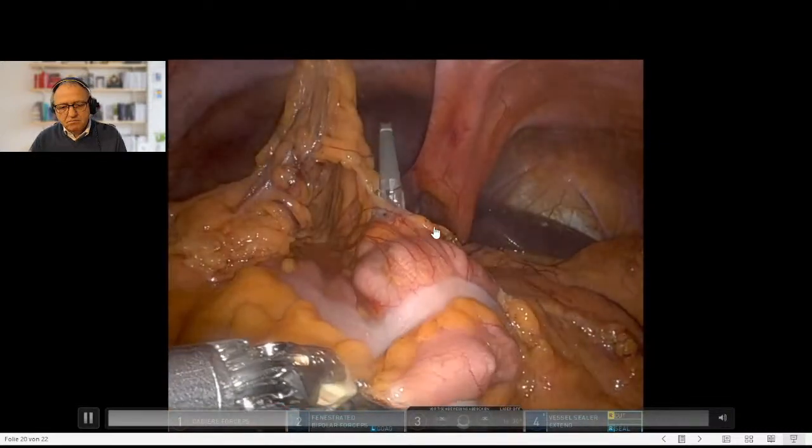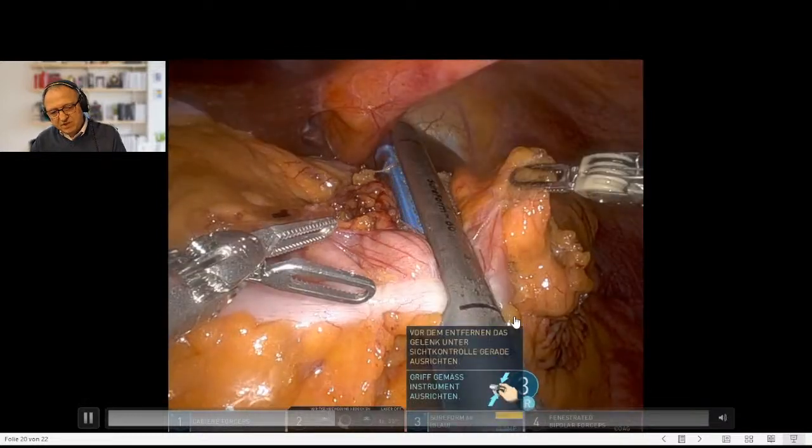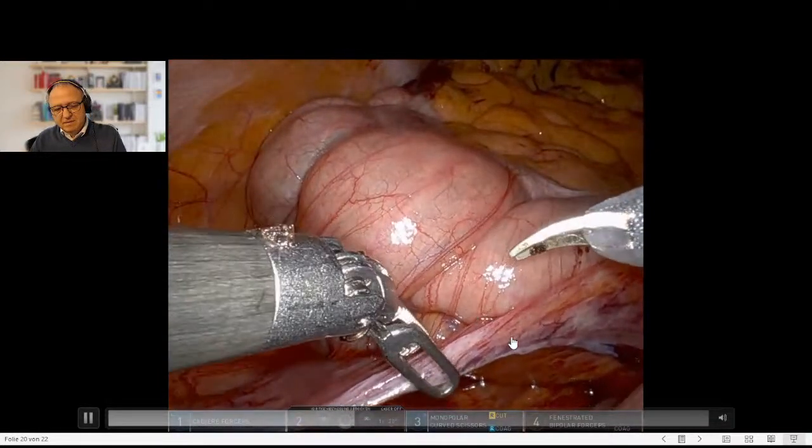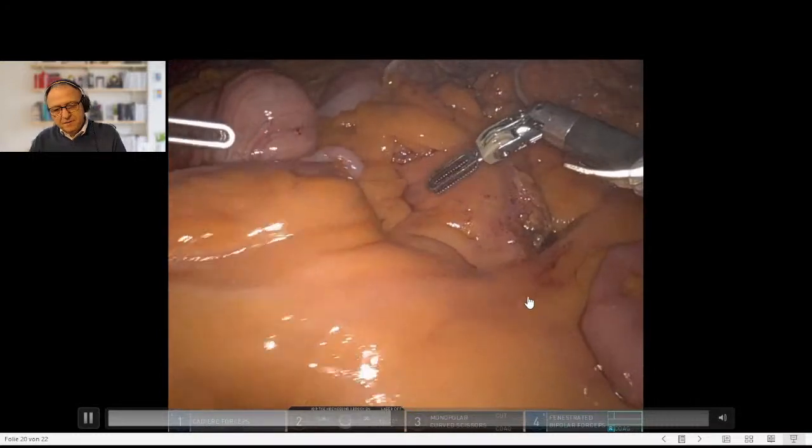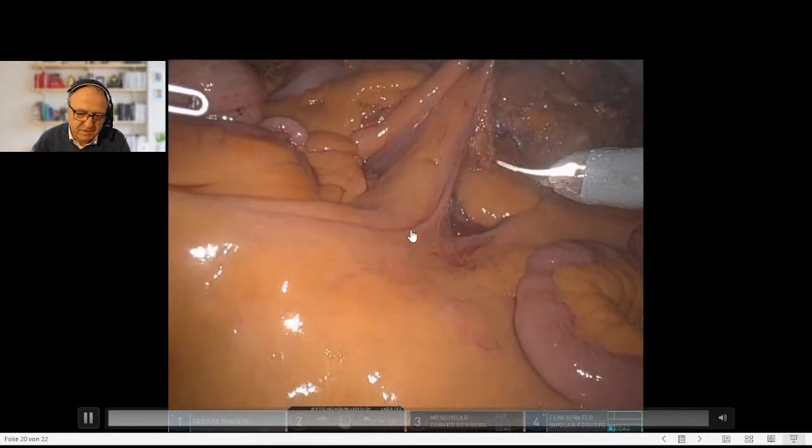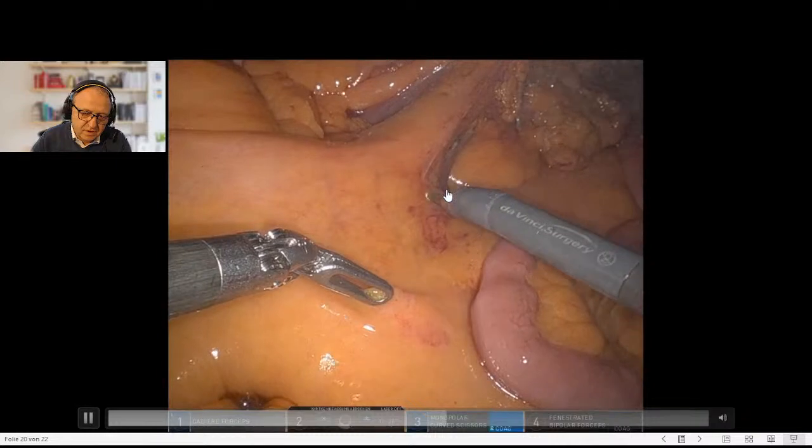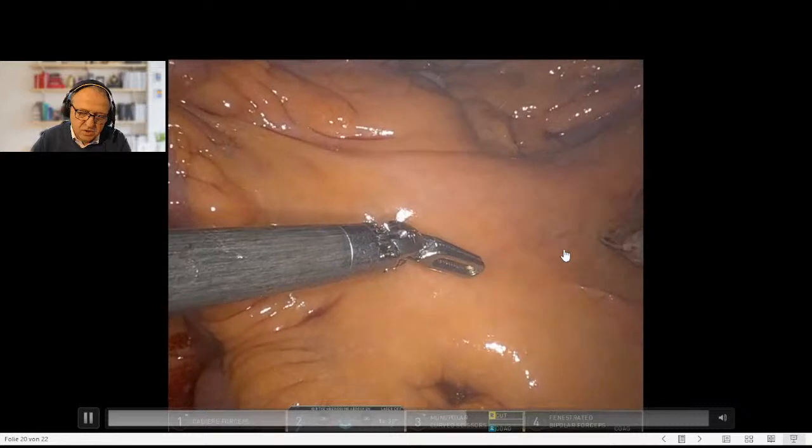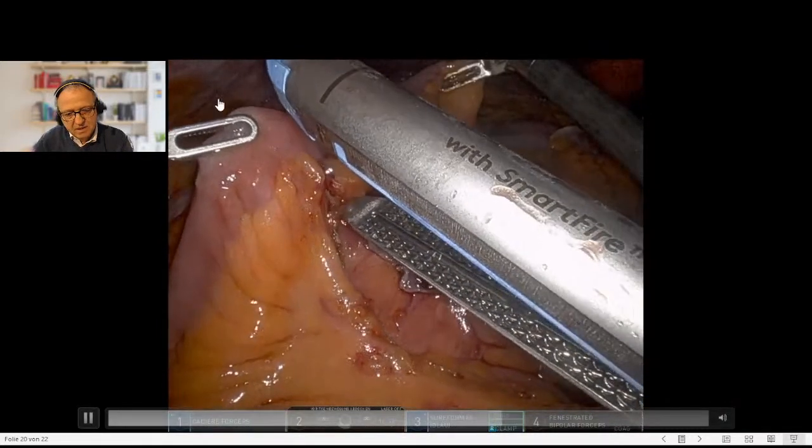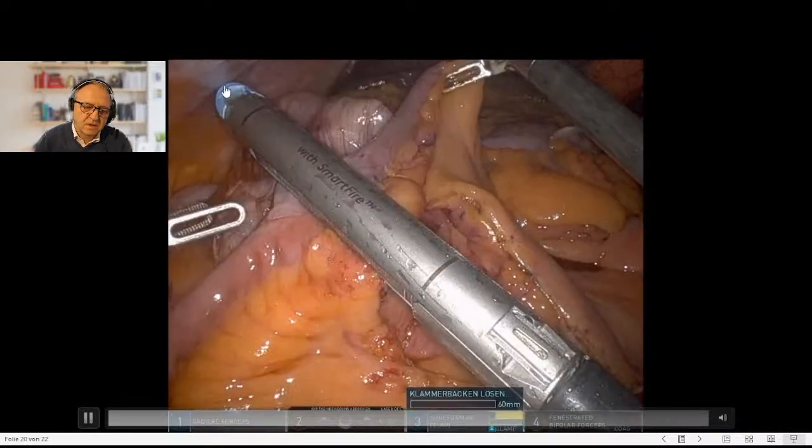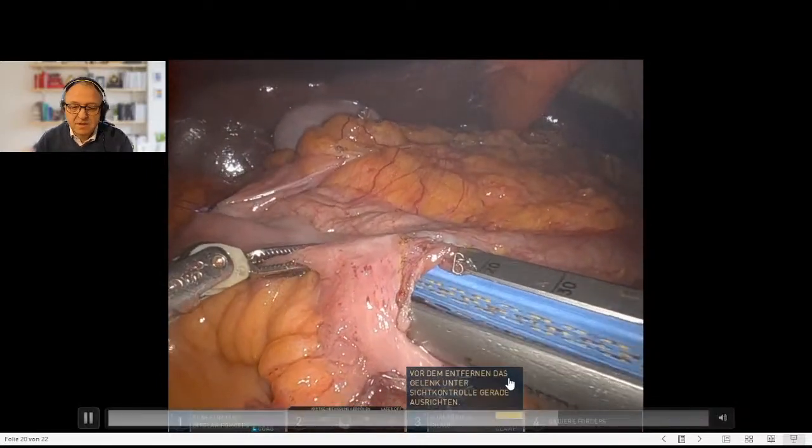Then we divide the mesocolon up to the transverse mesocolon and staple it with a robotic stapler. In this way usually there is no impairment of perfusion. Of course you can do an ICG test. It's very important to mark your way to the ileum because you very easily get too close to the cecum and impair the excision of the lymphatic drainage area there. Also staple the ileum.